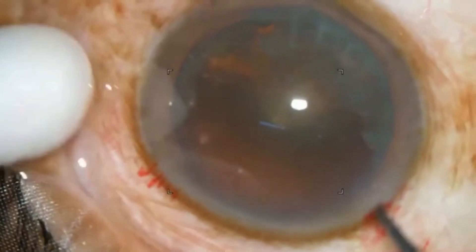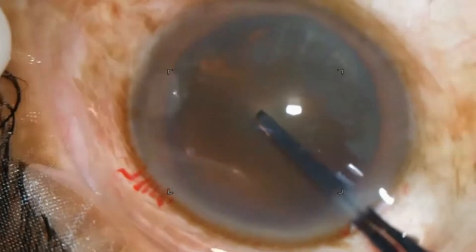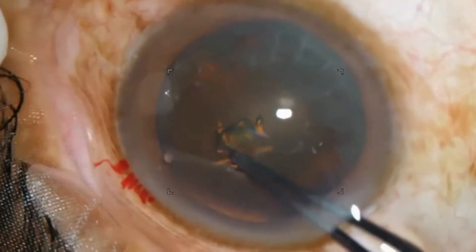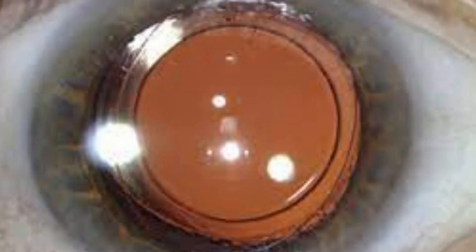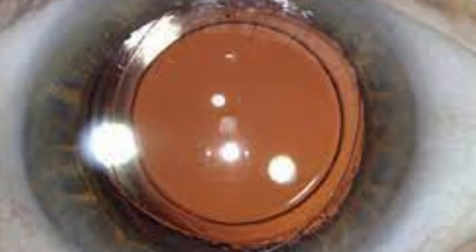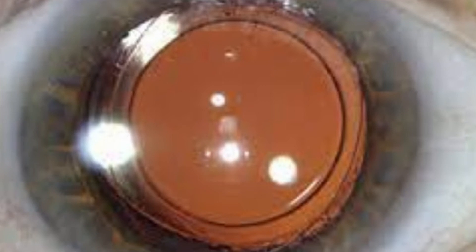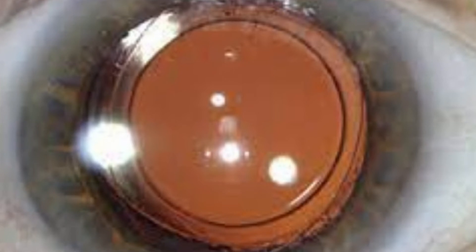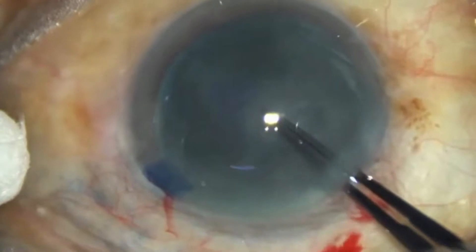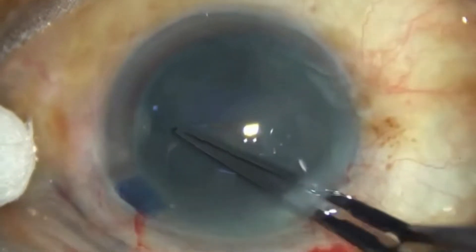A well-centered, adequately sized CCC is a prerequisite for successful phacoemulsification. It ensures safe and effective performance of various surgical steps and a correctly positioned intraocular lens with optimal rotational stability. CCC efficiently creates different sizes of smooth, circular capsulotomy with a strong capsular rim that resists tearing even when stretched during cortical removal and lens implantation.